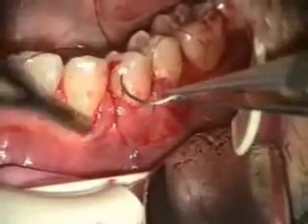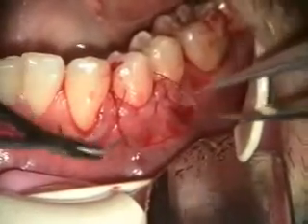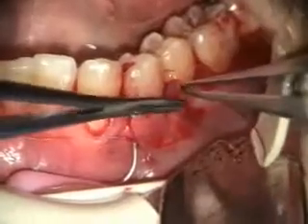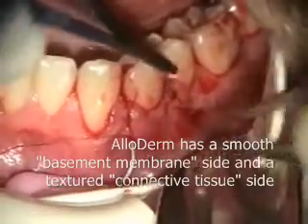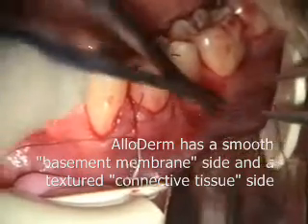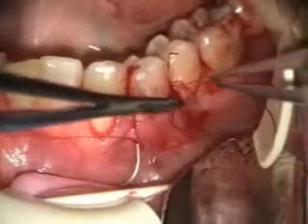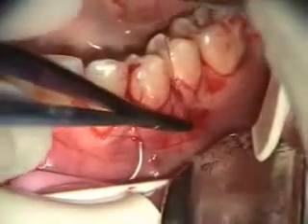Truthfully, I've been doing it that way for about ten years. Some people say that you can't put the alloderm connective tissue side on the flap side — it should be on the tooth side. Other people say it should be just the opposite. What I've seen in my experience is that it doesn't really matter.